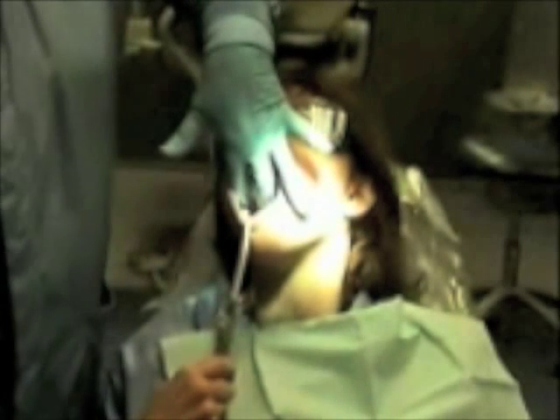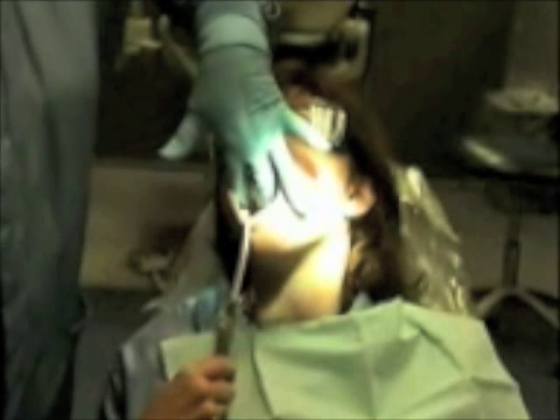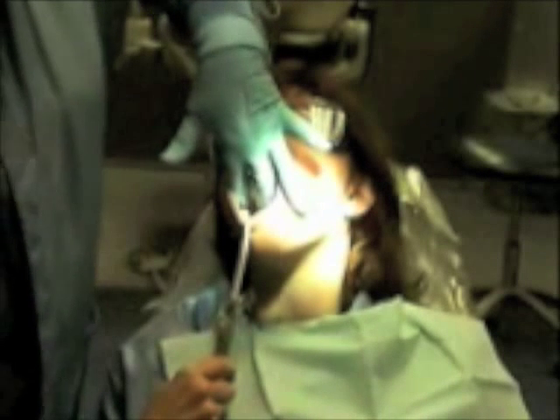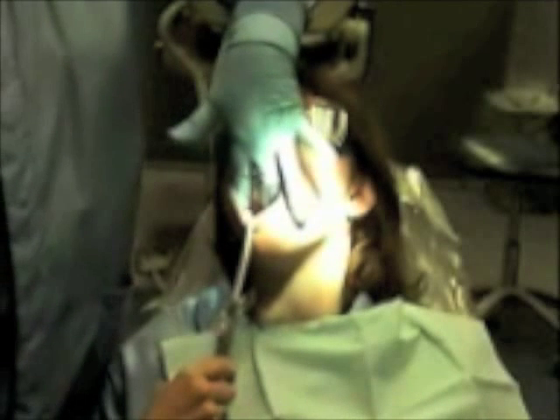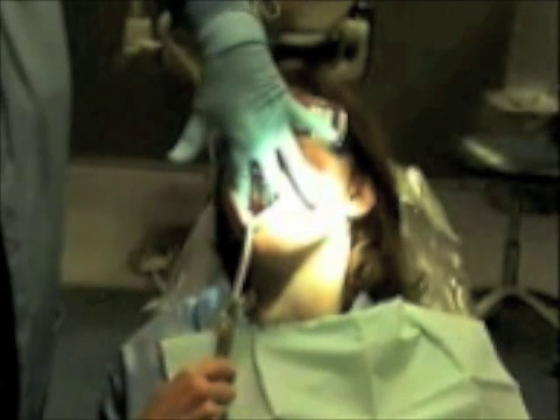The fluoride would then be painted onto the teeth with an applicator continuously for the recommended time — continuously if using the neutral sodium fluoride, or applied continuously for one minute if using the acidulated phosphate fluoride.